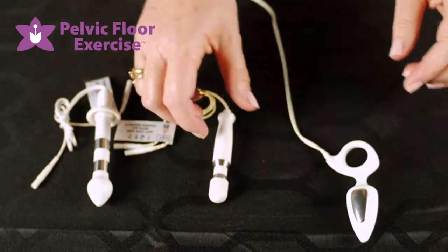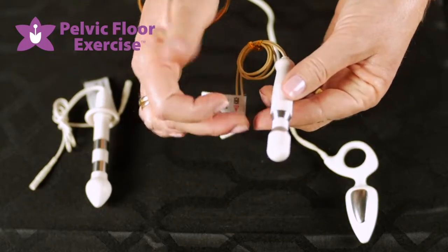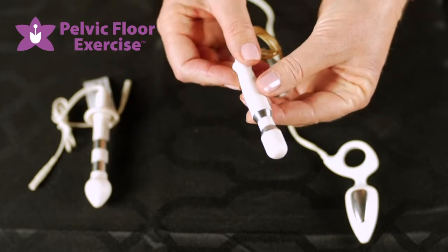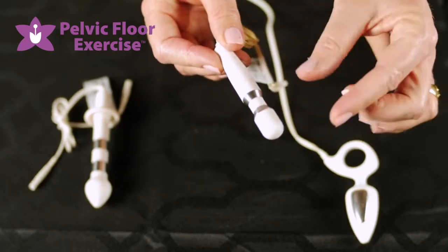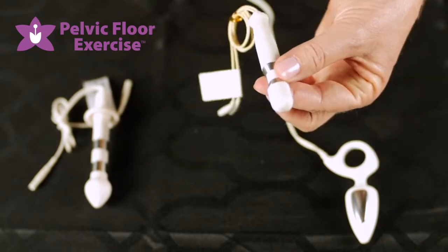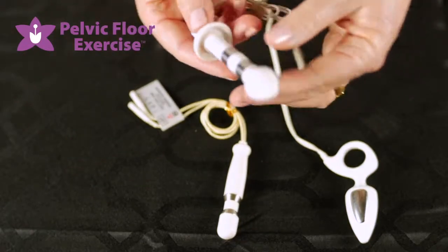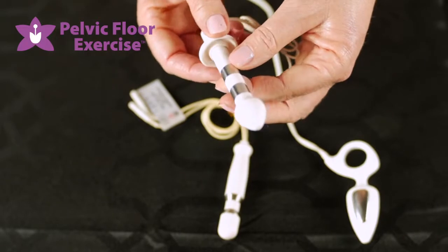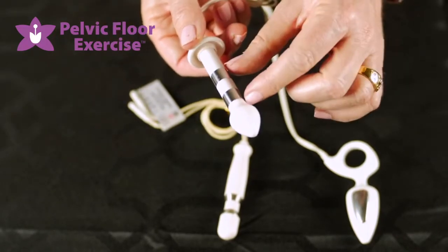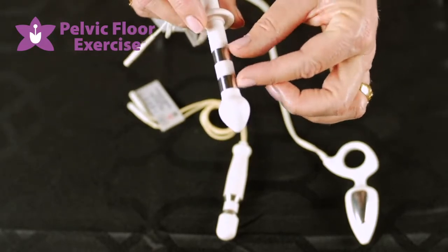For example, someone postnatally who's had some damage to that sphincter during birth. The next one, our very smallest, is the 10 mm with the dual circumferential electrode plates. This might be for someone who's got a smaller anal verge or is a smaller person. The third one is the 12 mm anal probe with circumferential plates as well, which means that you're more likely to get contact with the tissues.